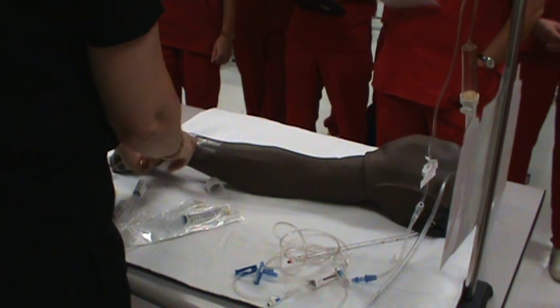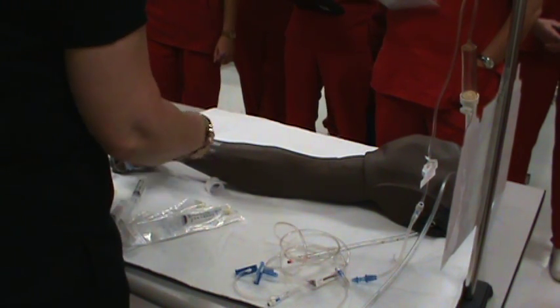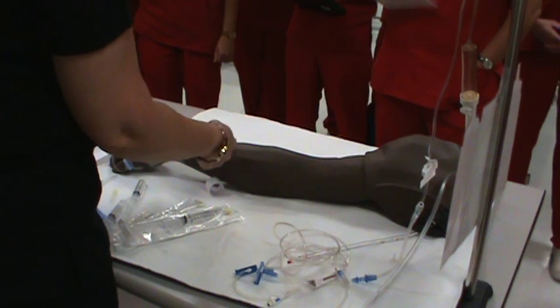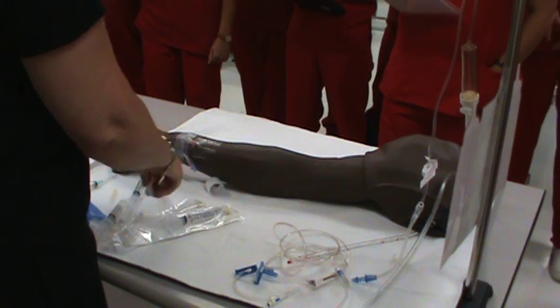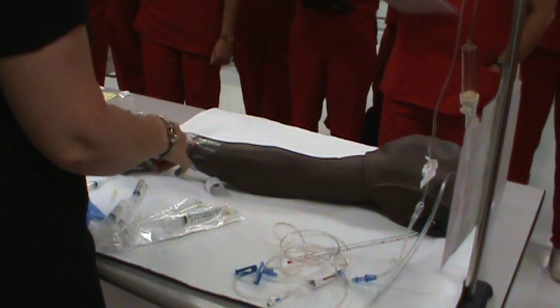Of course, unclamp it then. Same rate as the medication. Slowly inject the medication. Okay, that was wrong. So let's do saline lock. Clean injection port appropriately with the antiseptic. Slowly inject medication and verbalize appropriate time.